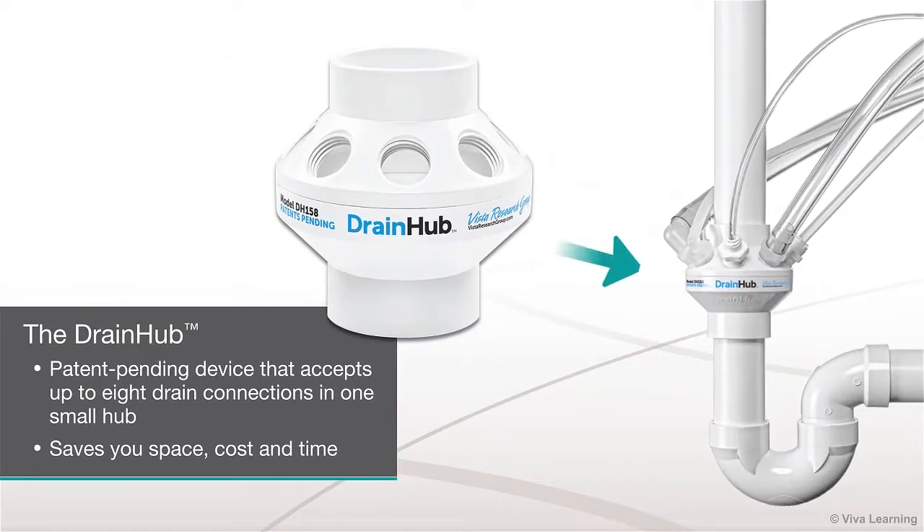The DrainHub is a patent-pending device that accepts up to eight drain connections in one small hub, thus saving you space, cost, and time.